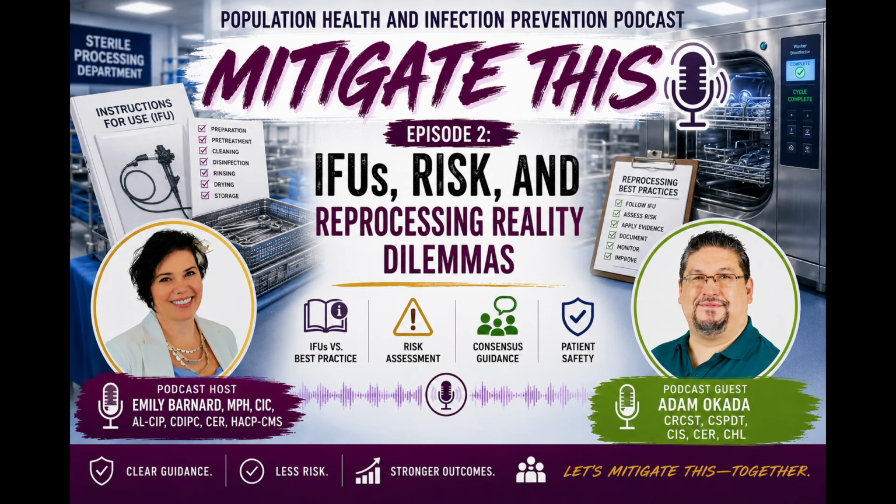For infection preventionists, I think the biggest thing to do to start is to go to sterile processing and ask questions. Just say, what are you doing? Why are you doing it that way? All those kinds of things open up a conversation. Don't be judgmental. Don't say you're doing things wrong. Don't go into that stuff yet.